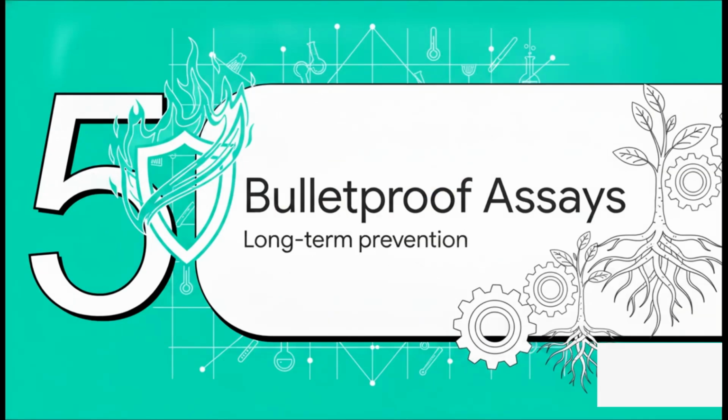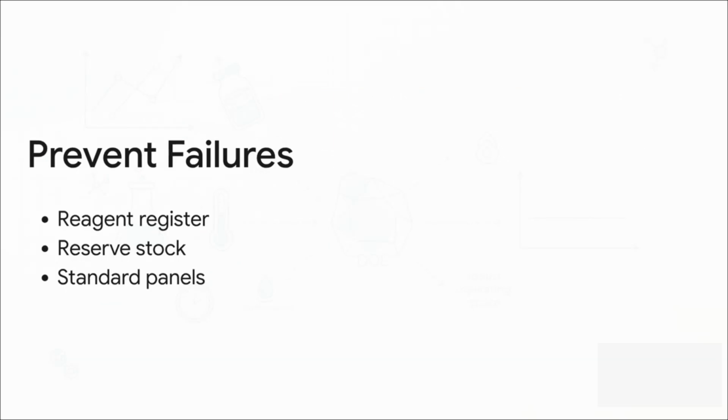Let's move to our final section, Section 5, Building Bulletproof Assays. Because ultimately, we want to stop fighting these fires and start preventing them entirely. The absolute best long-term fix isn't getting faster at your fire drills, it's establishing much better change control. First off, you've got to maintain a critical reagent register. Keep track of those lot numbers, storage history, and past failure patterns. Why make the next scientist rediscover all of that from scratch?